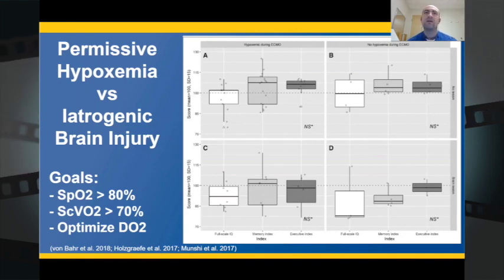So this is an important point because hypoxemia often makes bedside providers nervous and may lead to interventions that put patients at risk for complications. Interventions may range in complexity and propensity for iatrogenesis, but could include cannula advancement leading to bloodstream infections or drastic measures such as placing a second cannula.